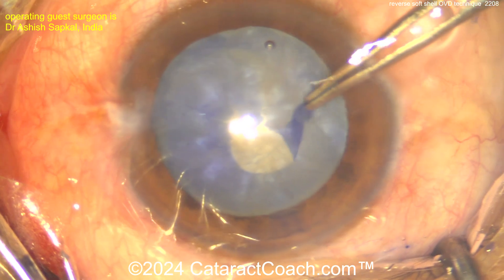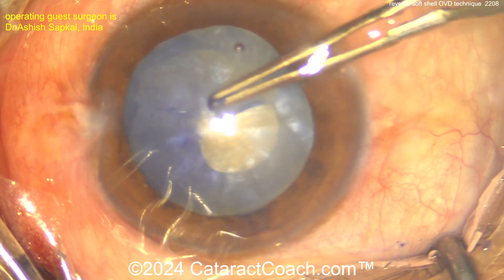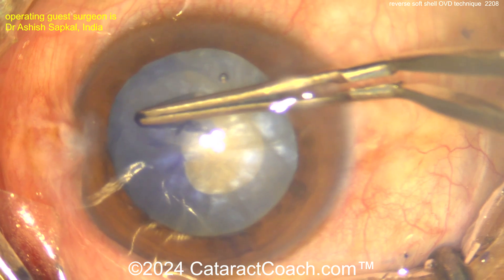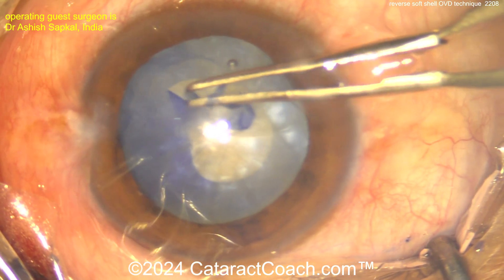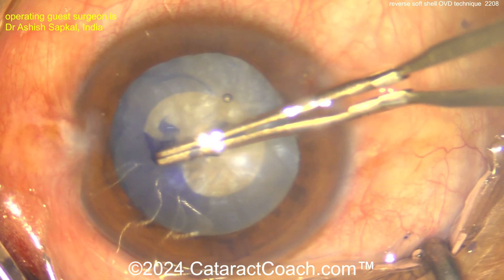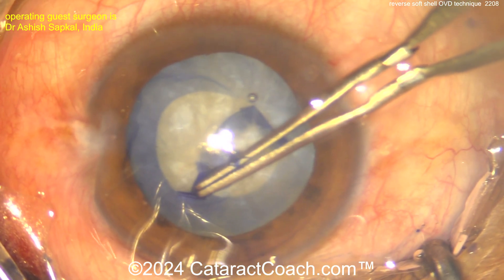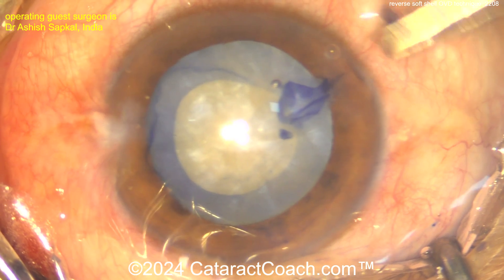The surgeon claims a zero rate of Argentinian flag sign using this technique. It's the first I've heard of it, so I'm presenting it here so we can all learn together. It uses dispersive viscoelastic in the center of the anterior chamber, and cohesive viscoelastic 360 degrees in the angle — on top of the iris and on top of the peripheral anterior lens capsule — then essentially a double rhexis technique: a small capsule opening made initially, allowing fluid to egress, then more cohesive viscoelastic placed on the peripheral part of the lens.